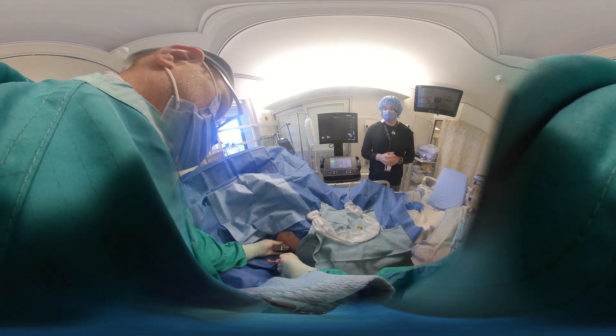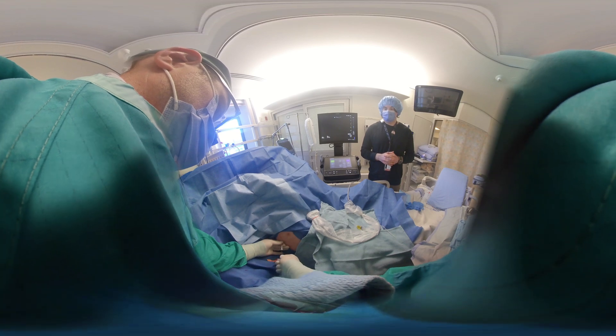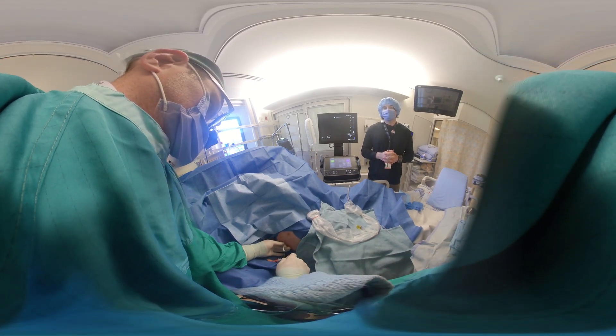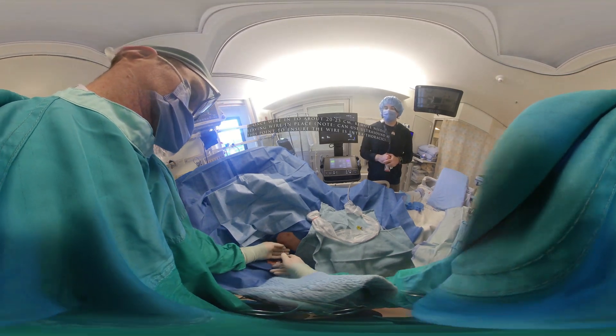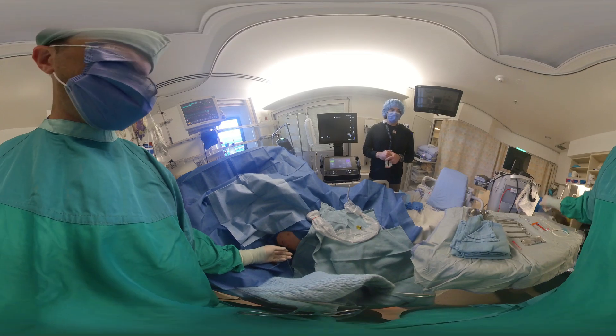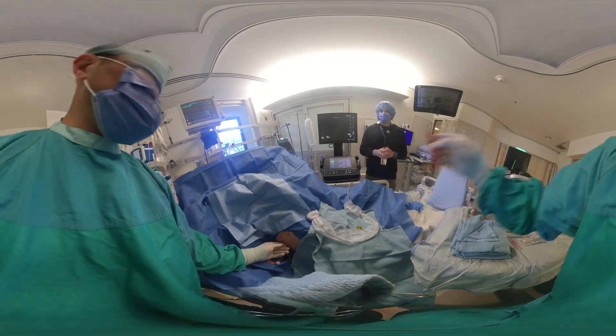Once the wire passes roughly 15 to 20 centimeters, it's okay to remove the needle and the plastic assembly on the back. You have a nice clear tract now — you can make a small incision just to allow safe passage of the dilator itself.